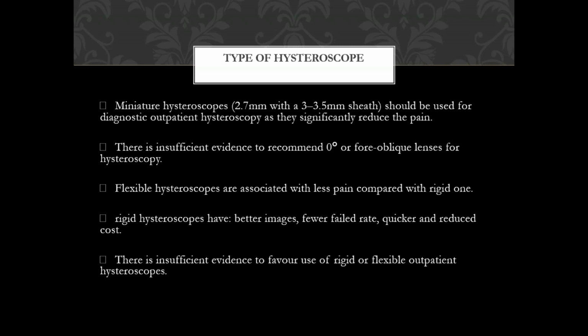Okay, this is about the telescope. The camera is different in hysteroscopy. We have 0, 12 and 30 degree cameras. We almost always use a 30-degree camera in our gynecology practice. We have two options for hysteroscopy, flexible and rigid hysteroscopy. And you can see from the, okay, maybe I have to maximize the screen.